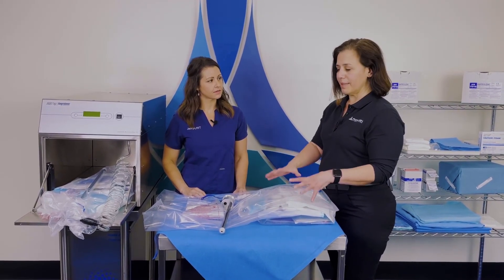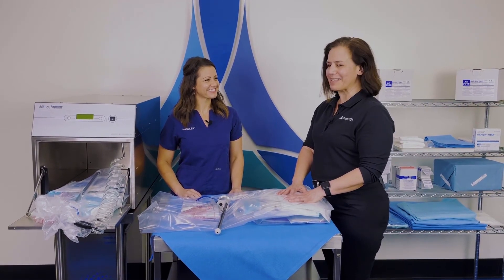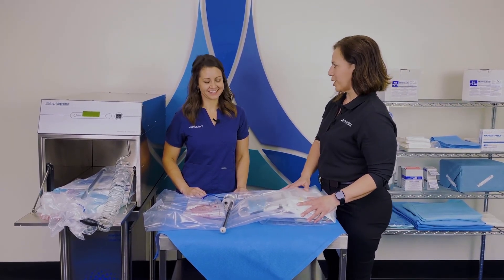So that's the way this system works — our Anprolene systems. We do have heated chambers, which will probably be another video, but the Anprolene system is one of the most popular with the veterinary markets.